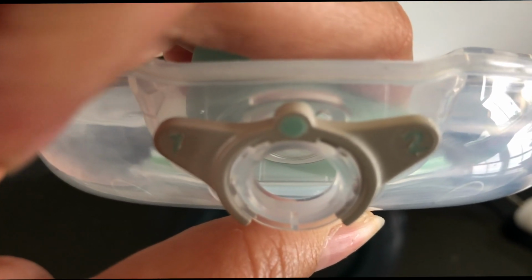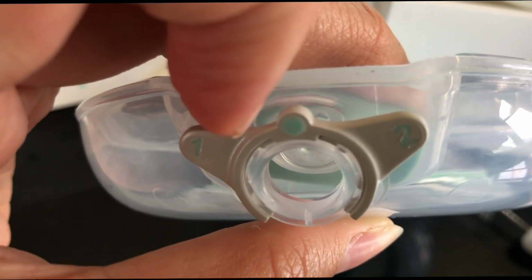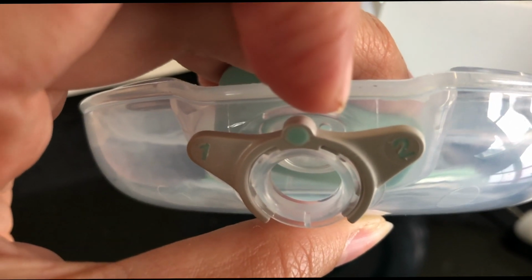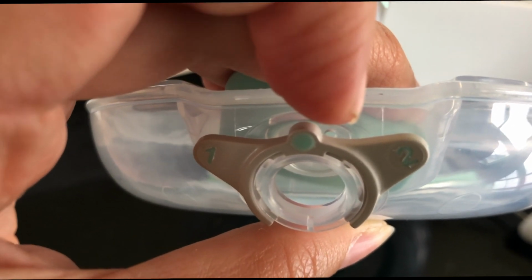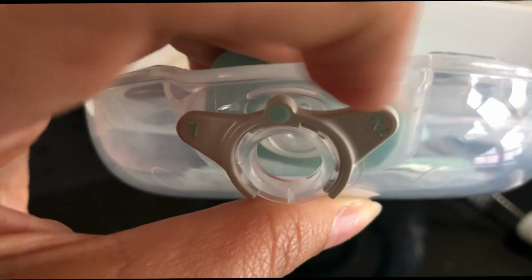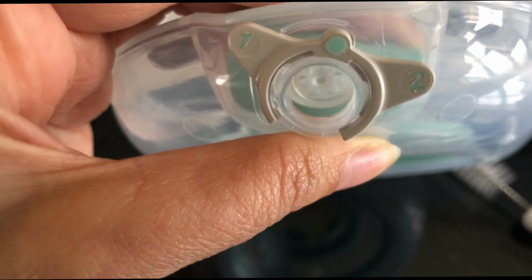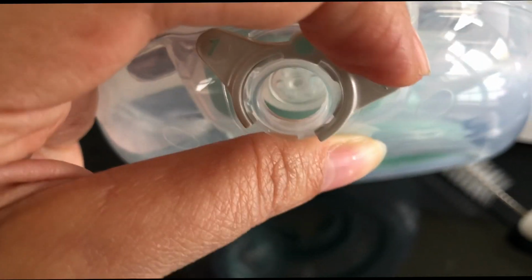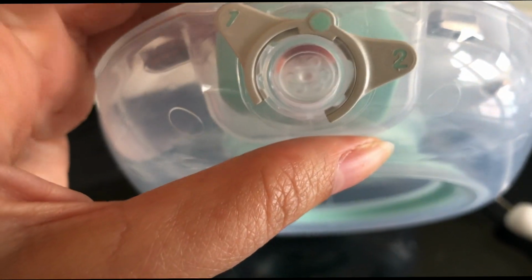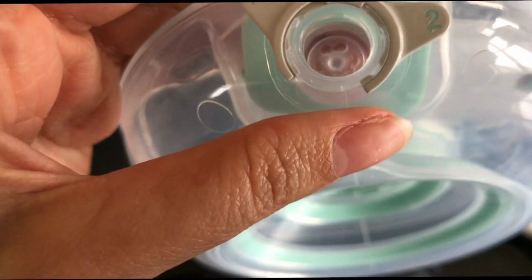You guys see that little hole? So when you're on a 1, you have a little vent hole right there where I'm pointing at within my nail. That needs to be open while you're pumping. When you're done pumping, you want to put the dial on 2, which basically just covers up that vent hole so nothing escapes when you're about to do the flip to finish, and obviously empty the milk.